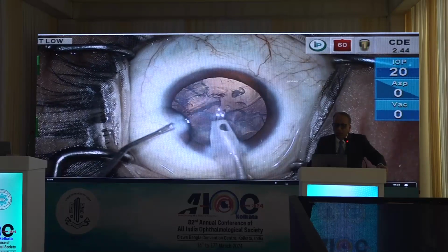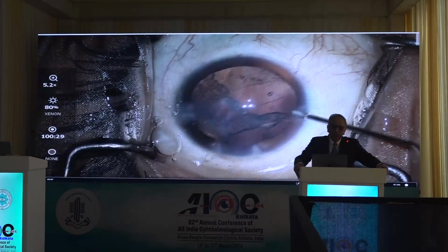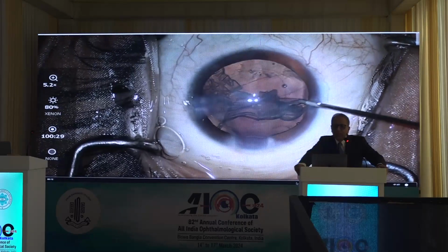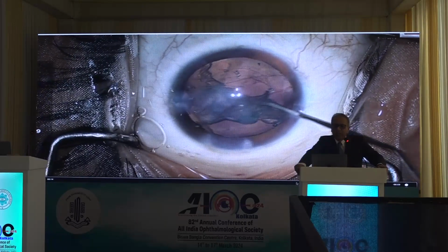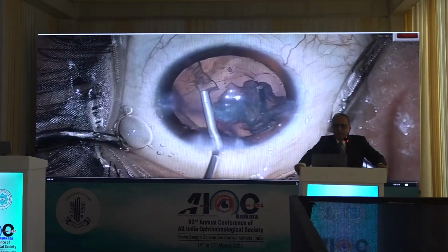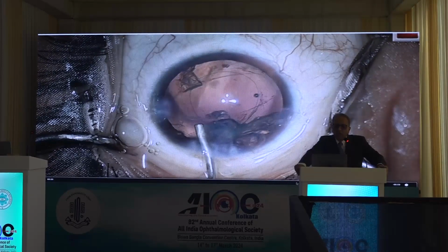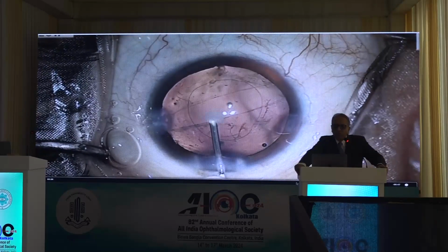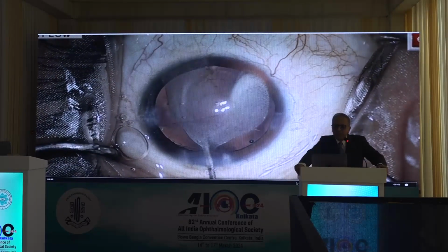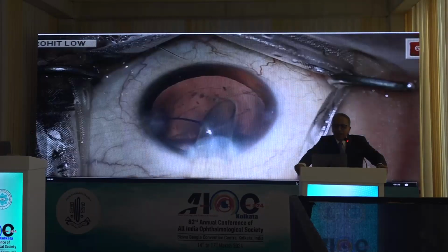Now once that is completed, I'm using stable chamber settings. Next, what I'm doing is the Gills-Welch dry aspiration. In this, the steps are irrigation, aspiration, fixing, teasing and stripping. You use a 25 gauge cannula, and then I'm visco expressing it out. So you could have used a bimanual also. Triamcinolone being used, and you will find there is hardly any vitreous disturbance in this patient. And once that is done, I can easily implant an intraocular lens.